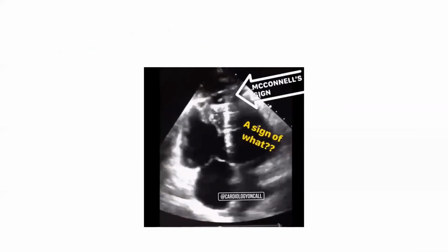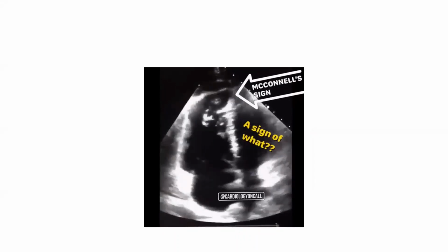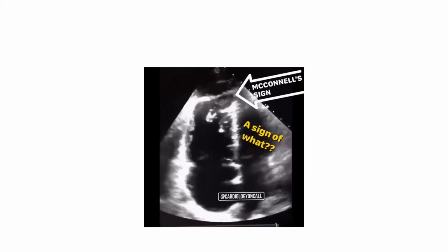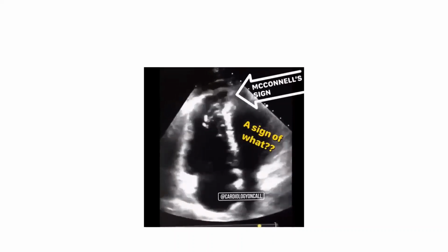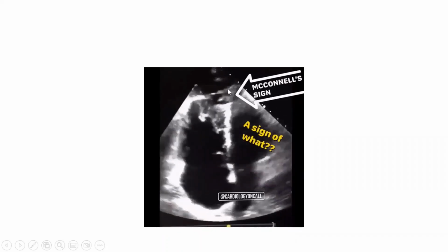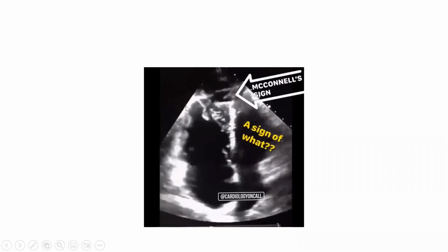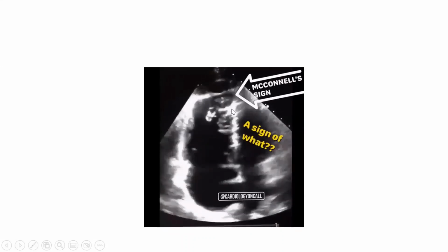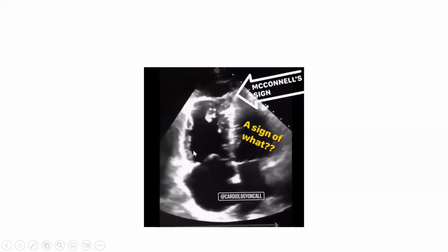I'm just going to take you to, what is this? Dilated right side. And what else? D-shape. Very good. D-shaped LV, exactly. So most likely it is suggestive of pulmonary embolism. What do we see here? Look at that. Paradoxical movement of the septum. Leftward shift of the septum. Dilated RV. What else?